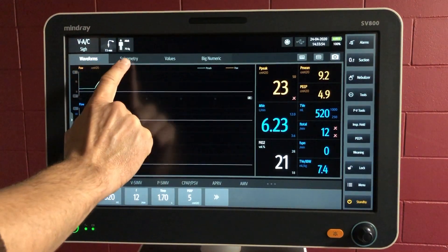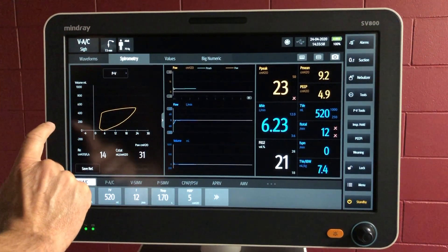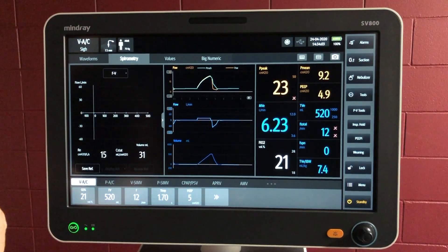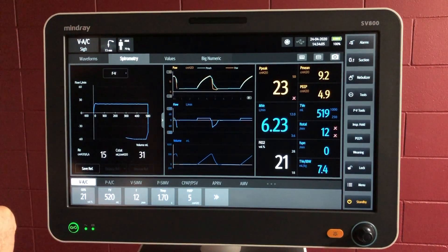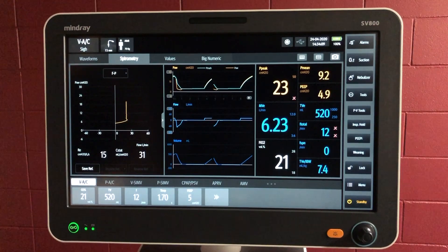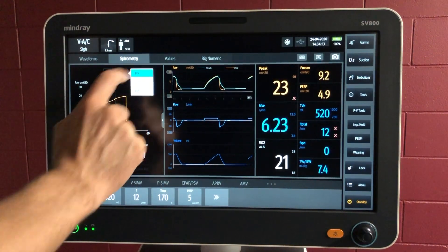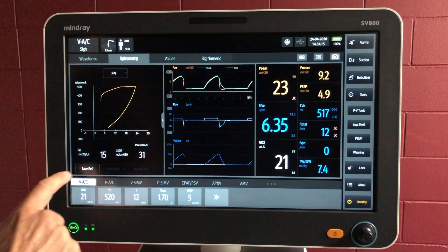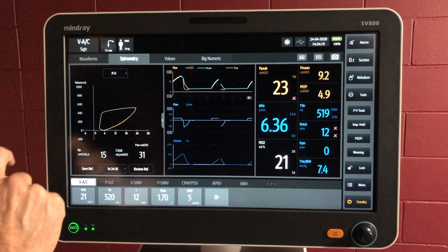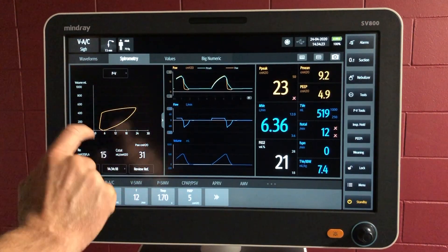Under the spirometry tab we can view the different graphs of spirometry — we've got pressure versus volume there, flow versus volume, and flow versus pressure as well. If we want to, for any of these spirometry readings, we can save a reference here, and then the consequential waves will be measured against that.